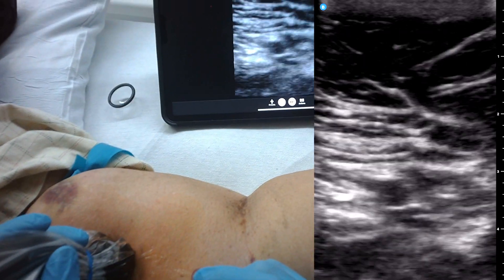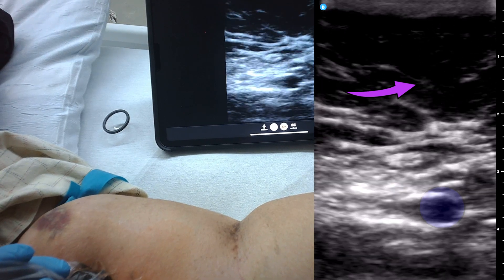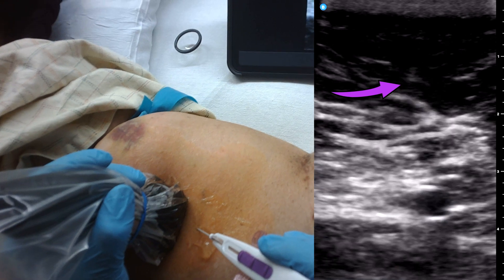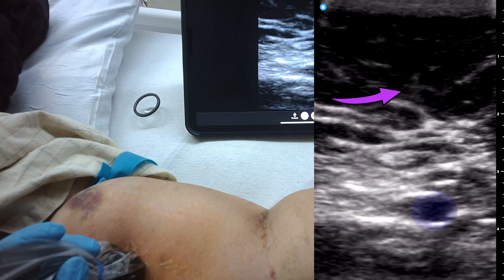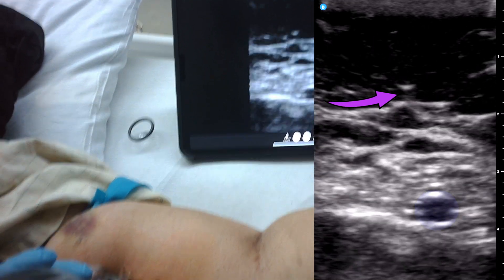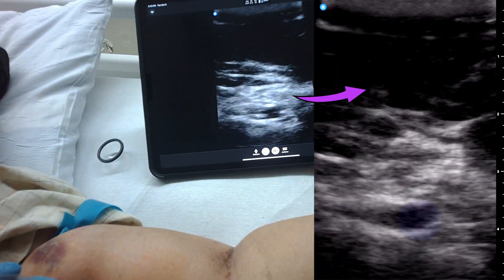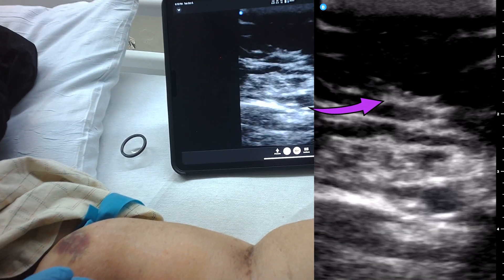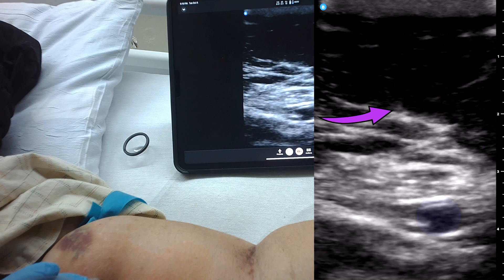Not too bad, right? Now I'm trying to locate. Do you see that movement at the top here? Do you guys see how I'm bouncing the needle? I'm bouncing the needle — I'm not going in and out very hard or very much. I'm looking for that micro-movement and looking for a highlight, which is most likely the needle. I know that's the shadow. You guys see that shadow there? I know that's not the tip.